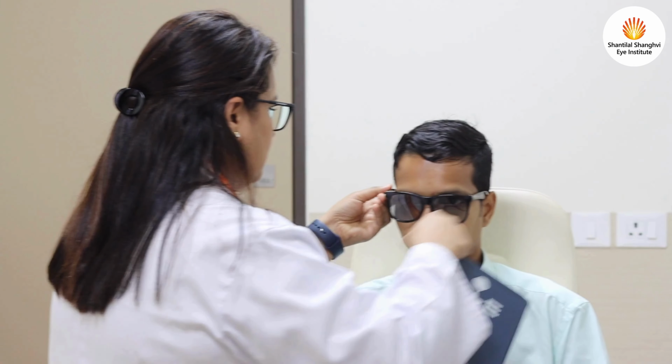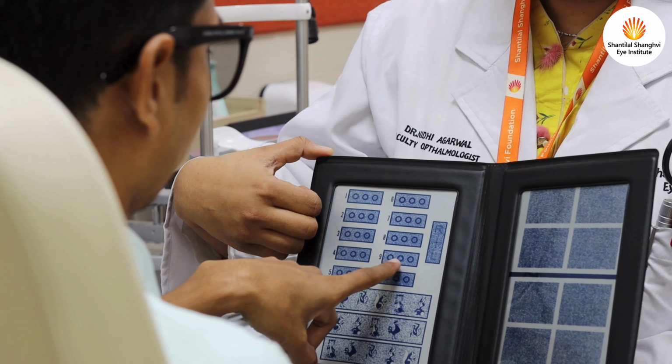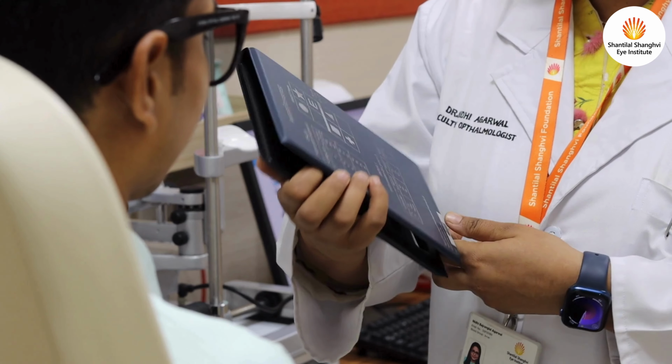Next comes evaluation of stereopsis, which can be done with the Randot stereo test using Polaroid glasses. Now here the patient identifies the 3D circle in each line and the value of stereopsis against the given line is mentioned at the back of the book.